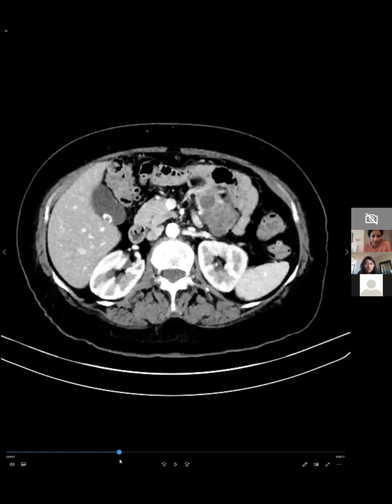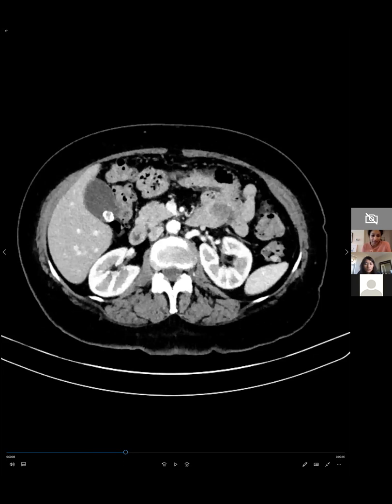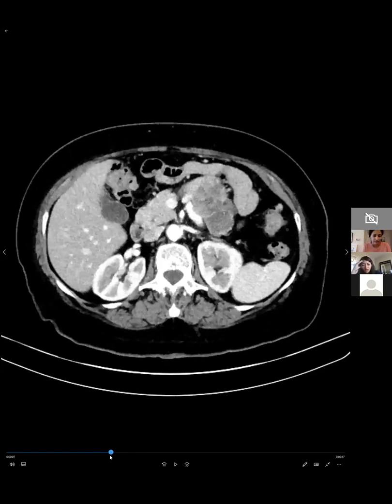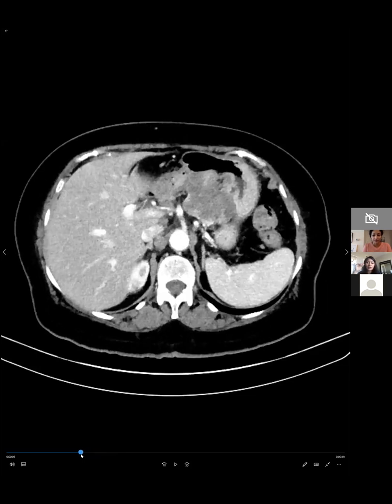Right there, it looks like there's a cyst hanging off the edge of it. Right. So that means there's no capsule to this lesion, and it has a little lobulated cyst hanging off the edge, which would be a little bit less common for a neuroendocrine tumor. There's also an acinar variant of pancreatic cancer that happens in the tail and is super aggressive, looking like this. Yeah, that's great. Those are more common in men, but definitely could be either. Yeah, so those are all great, and that's sort of what we were thinking, something along those differentials.